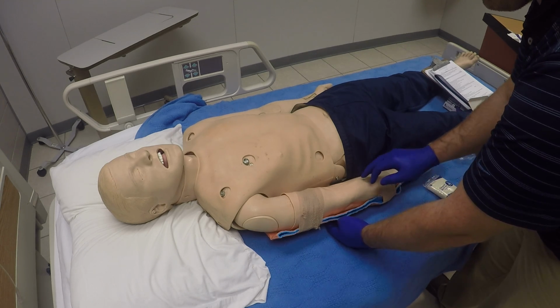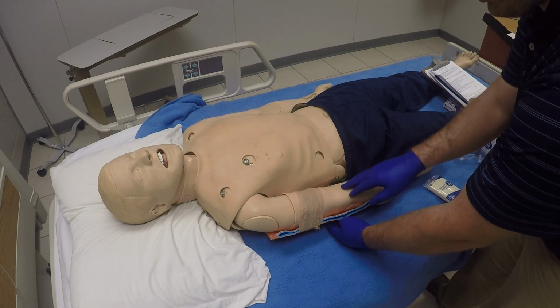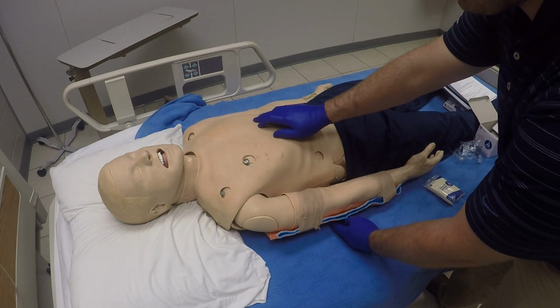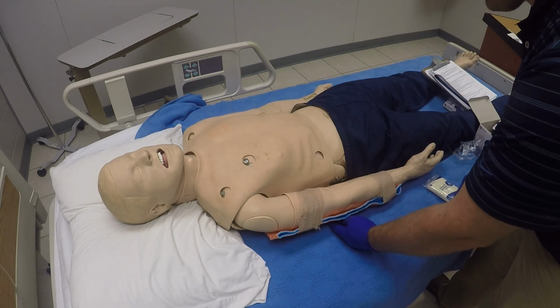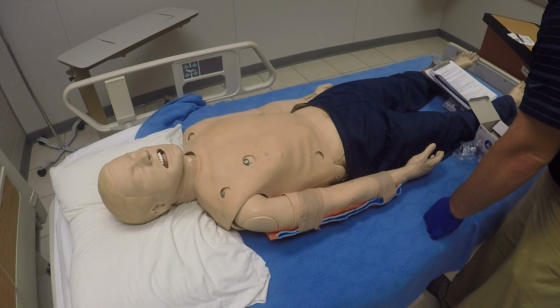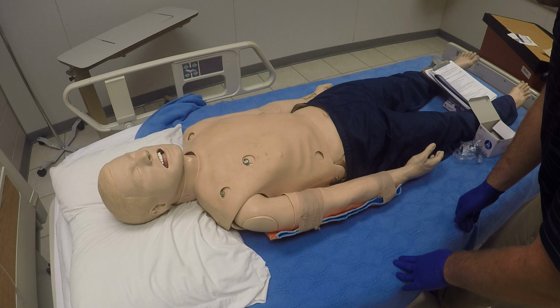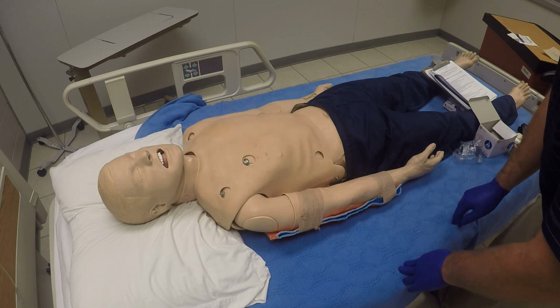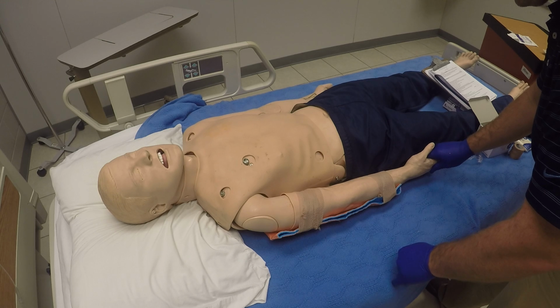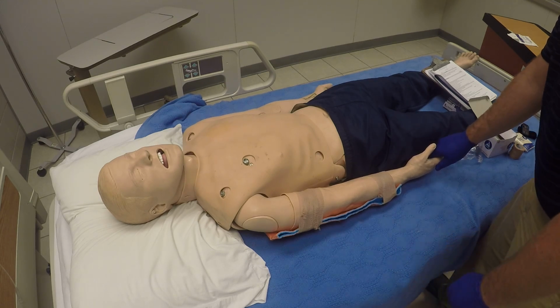If we're able to actually bend the elbow, if the injured side is someplace else and we can bend that elbow, we can secure the patient's arm across their chest, and we can do that with the triangle bandage as well. And then once everything is secured and in the proper spots, we'll go ahead and recheck PMS, checking our pulses, have them squeeze our fingers, wiggle their fingers, make sure all that's still intact.